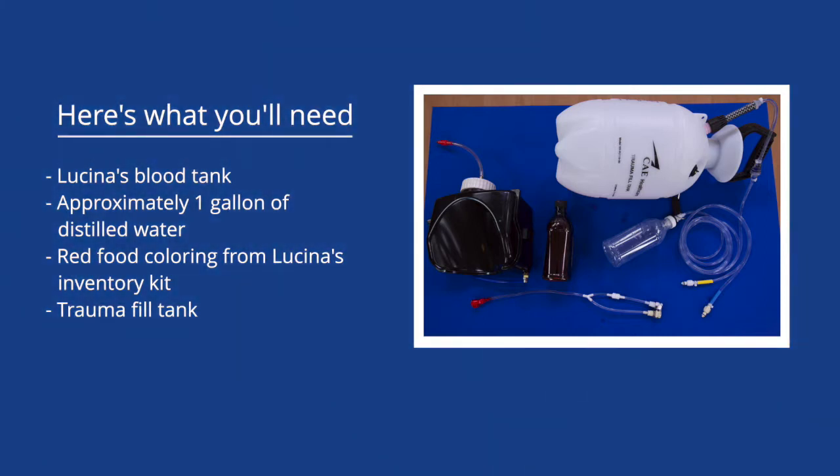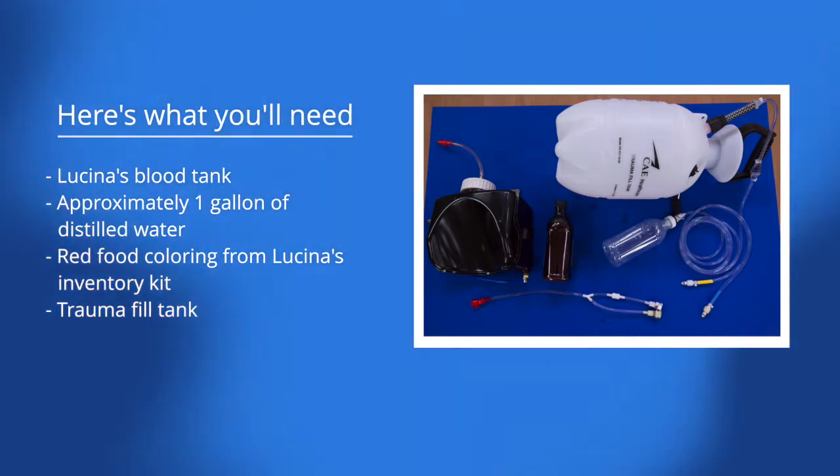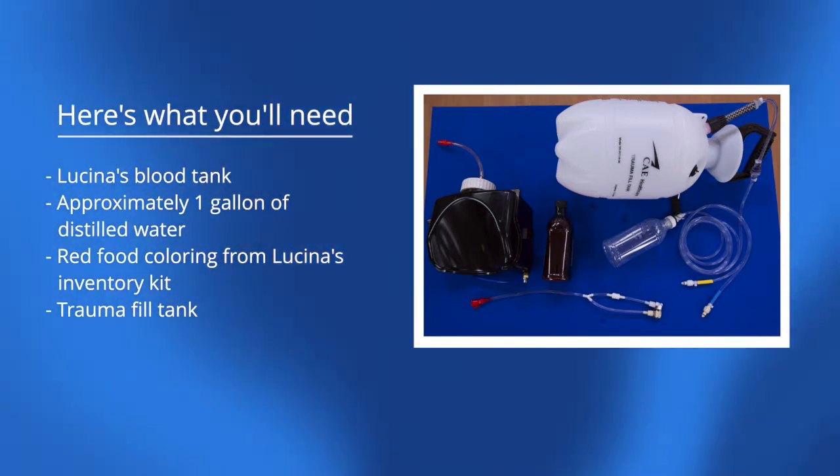Here's what you'll need: Lucina's blood tank, blood tank adapter accessory, approximately one gallon of distilled water, red food coloring from Lucina's inventory kit, and a trauma fill tank.